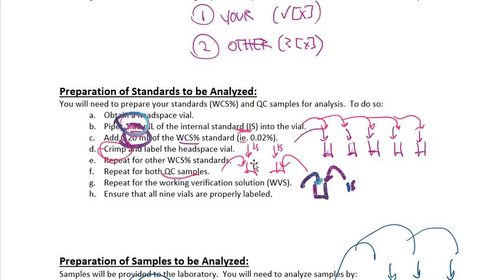But that way you can only focus on bits and pieces of the sample process, because we really need to be focused here on the instrumentation and the way the instrument's doing its job, not how you can prepare standards and samples the proper way. That was the purpose of the 150 class. That's not the purpose of the 210 class, okay?